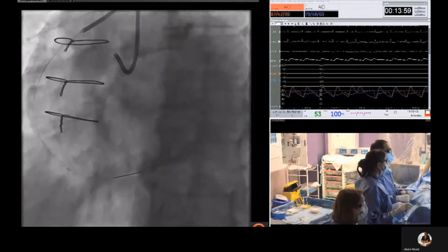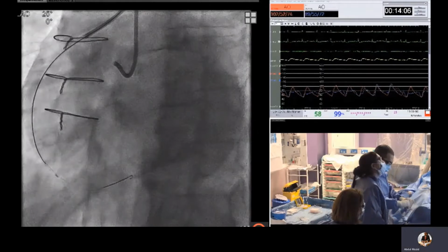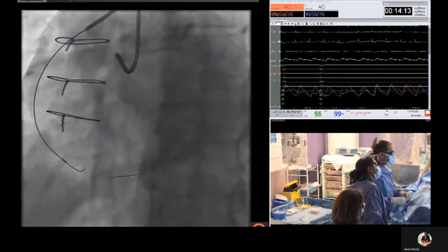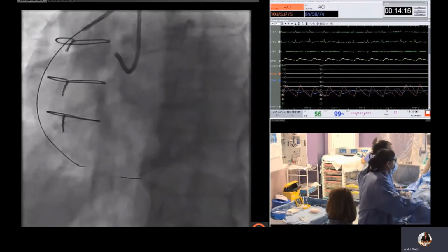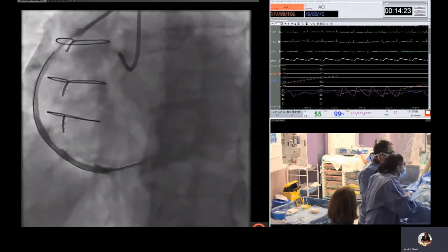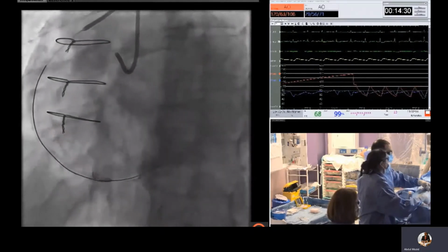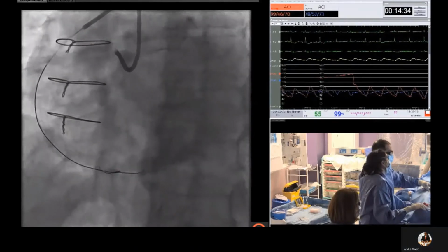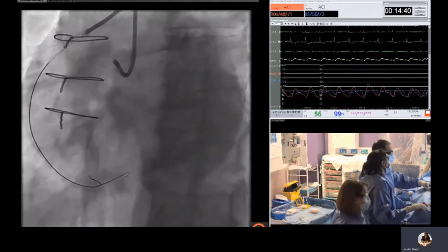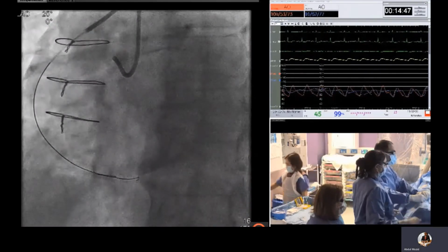So I then took a Miracle 12 wire, which has nice support from the tip of the wire, which transitions to the core of the wire to the shaft, and this then allows you to deliver your equipment on the wire when you have short working distance such as this. So here with the Miracle 12 delivered, you'll see initially prolapse, but then once it's brought back, it then allowed the Mamba Flex to negotiate this angulation.